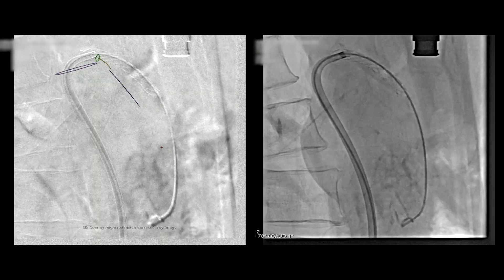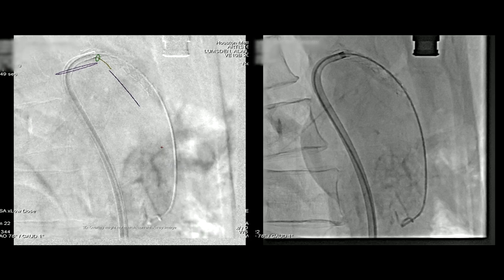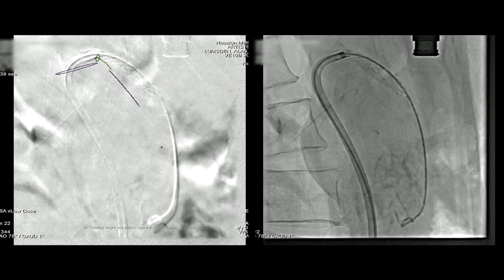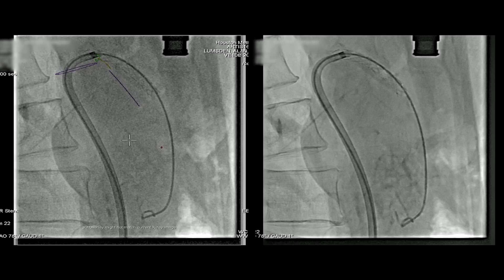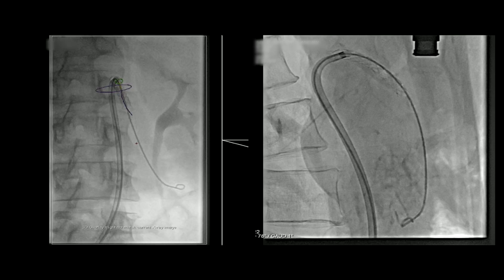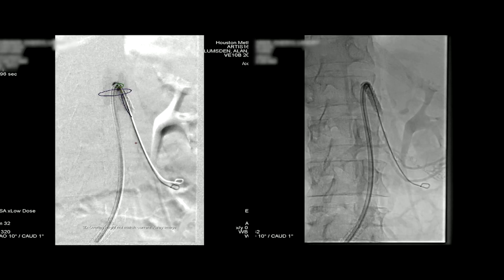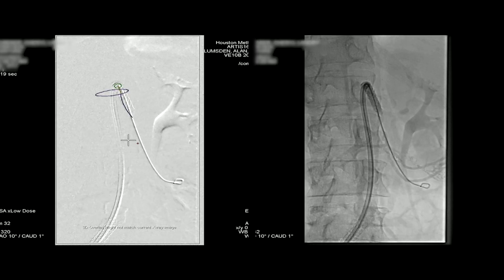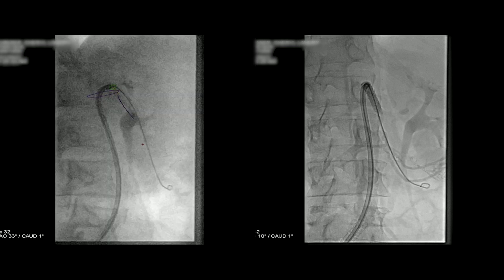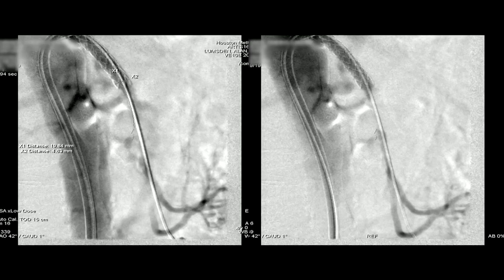Now what we've got to define — and you can see we're injecting here — it really doesn't go down into the distal superior mesenteric artery. So we've not completely covered it. What we want to do now is define the first branch of the superior mesenteric artery, so we're going to replace our catheter. The catheter is placed more or less in the distal superior mesenteric artery because we've got to define the distal extent of the next stent without sacrificing any of the collaterals or the branches to the distribution of the superior mesenteric artery.